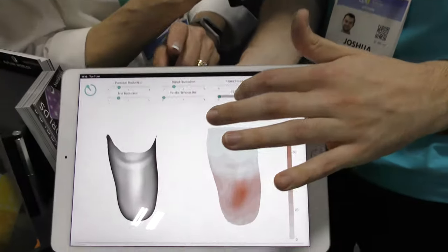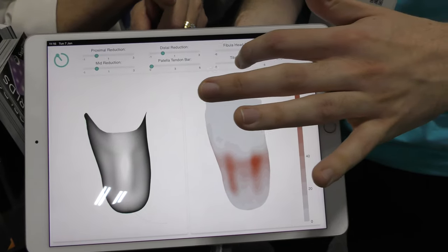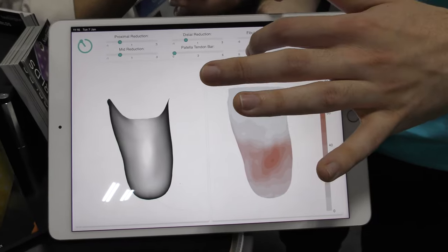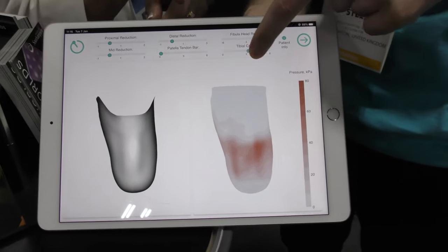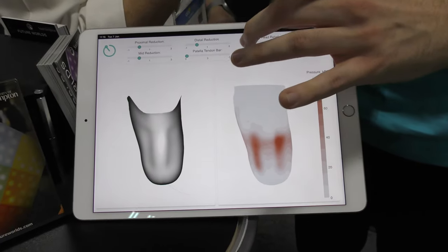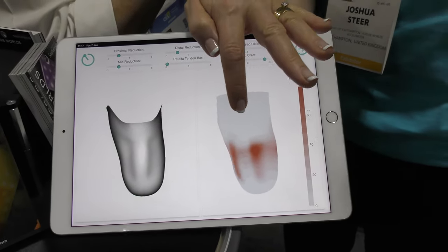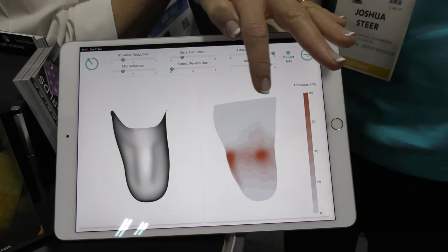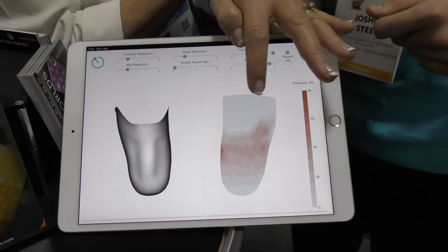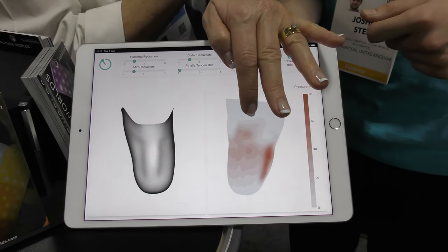There are six sliders here that are controlling the design of the socket itself, and then we're watching these red spots get darker. You can go right over to the right there — this would be painful — but we can redistribute the pressures and change the distribution across. We can even rotate the heat map and we're seeing the different pressure points all the way around the limb.